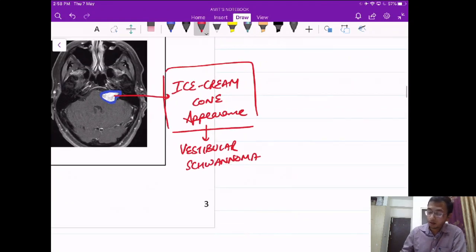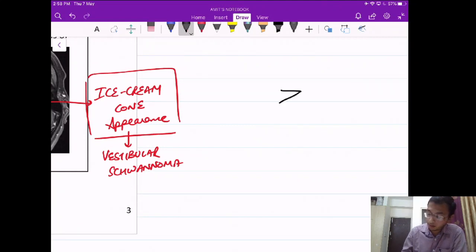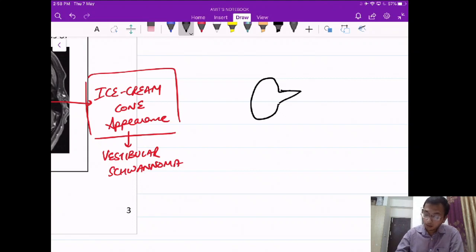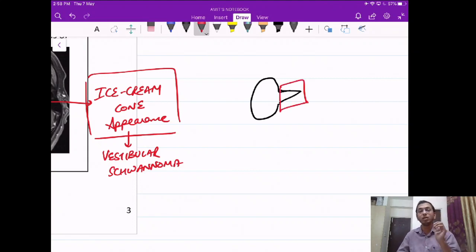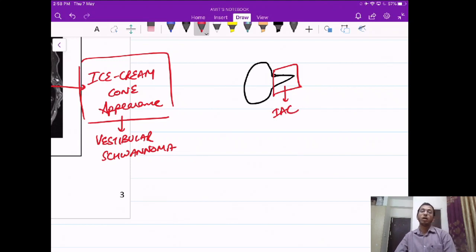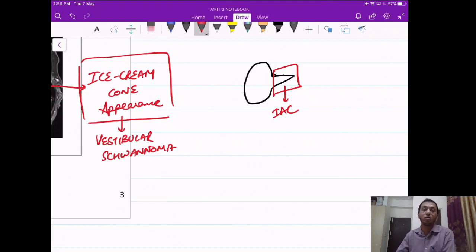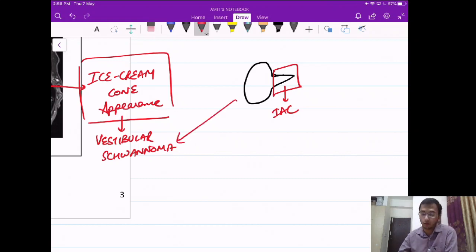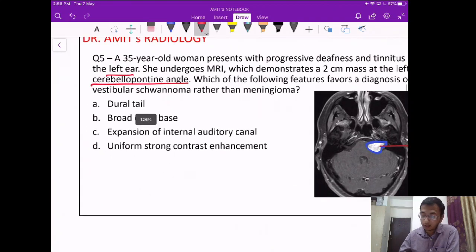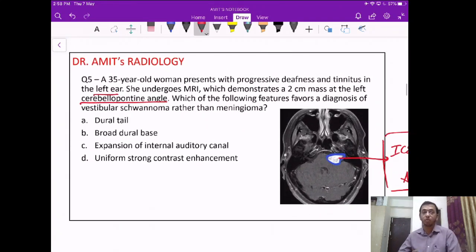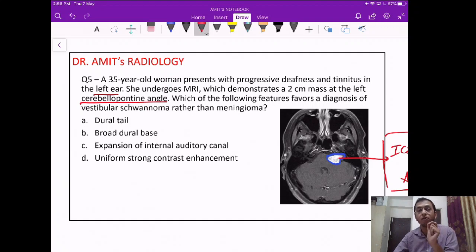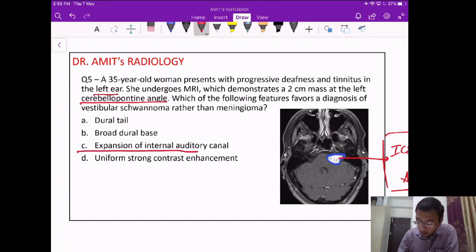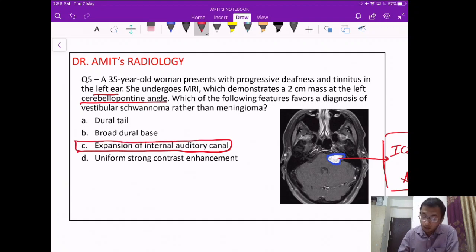Looking at the image, the appearance is known as the ice cream cone appearance, very characteristic for vestibular schwannoma. The cone is formed by the part of the tumor that extends inside the internal auditory canal along the vestibular nerve, giving the ice cream cone appearance. So the answer is C — expansion of the internal auditory canal.